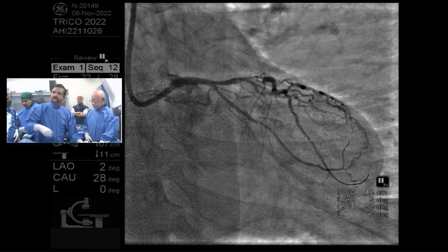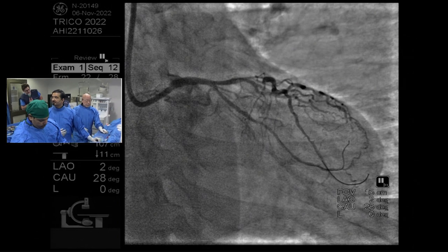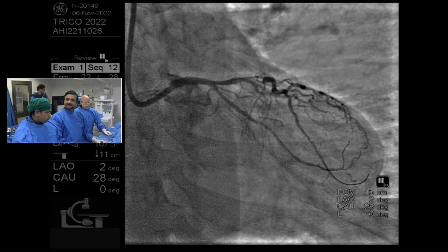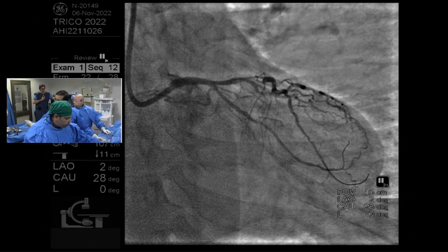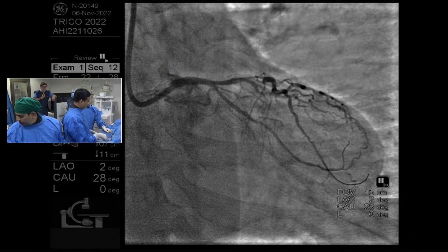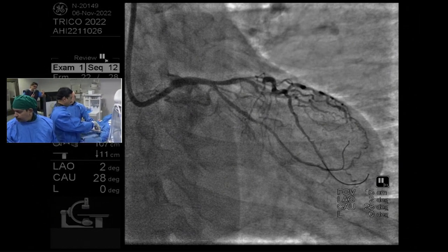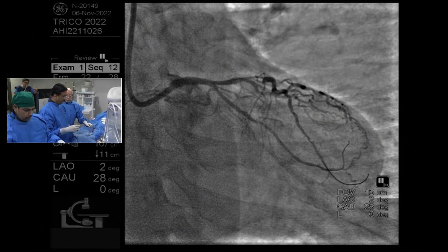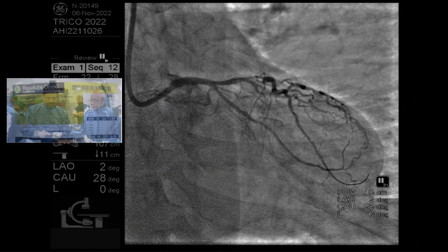If you see the guiding, I didn't realize, was it a 6 or a 7 French guiding, Dr. Saito, you have? That looks like a 7. I think it's orange at the hub. Yeah, okay. So if you look at that lesion, with a 7 French guiding, I think it's about 2.2 millimeters, so 2.3 maybe max, and you see that that vessel is smaller than the guiding, at least here on angiography. Consider that the circumflex is a bit further than the guiding, so you could underestimate it, but it still remains a small lesion, and that could be a good reason.